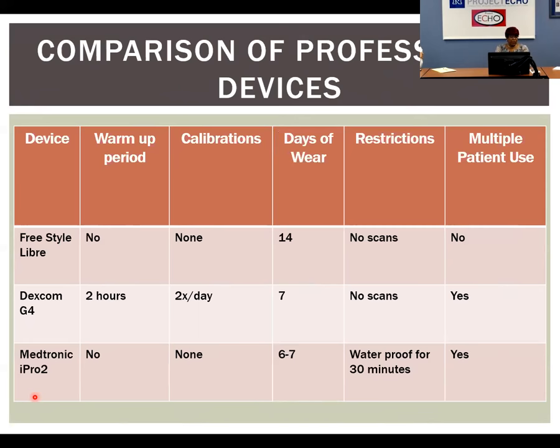For the Dexcom G4, there is a 2-hour warm-up period. And when we get into talking about patient wear, you'll see that there's a little hourglass or a clock on the screen that the patient has to be tuned into. And when it is fully green, they'll get 2 drops, but it does take 2 hours. And I've had those patients that will call back to the office in an hour and say, this thing is not working. Okay, they didn't really listen to the fact that I said it will take 2 hours before it begins to transmit any data. So it does take that full 2 hours.